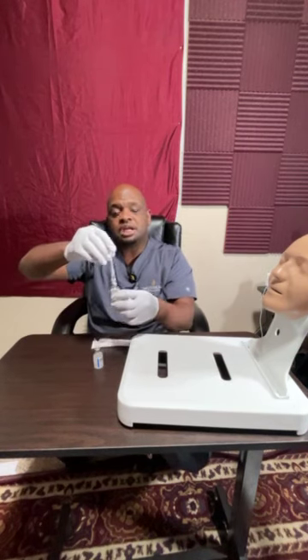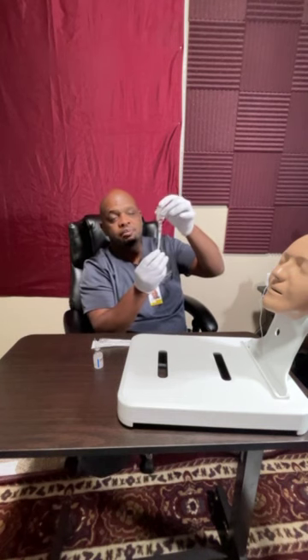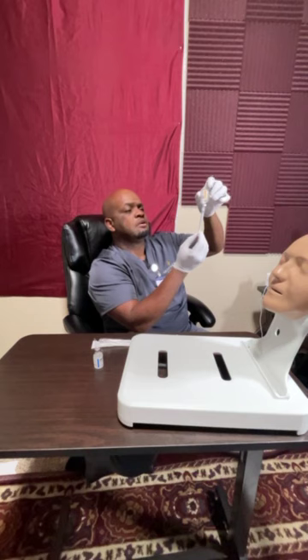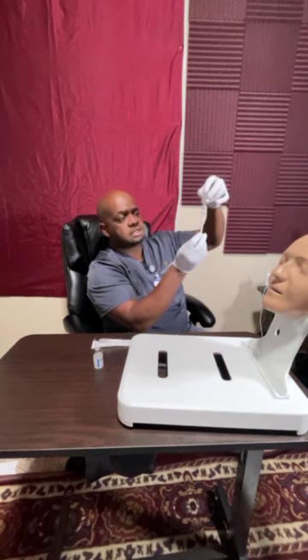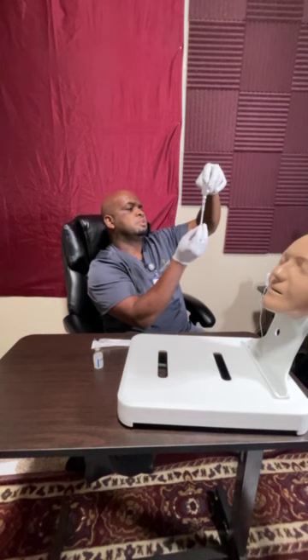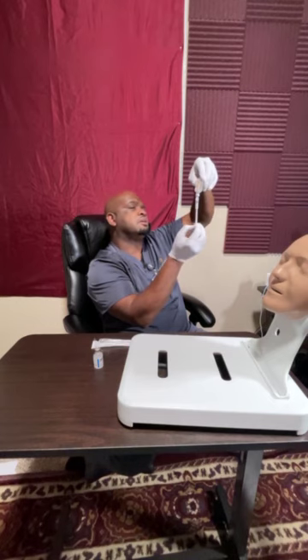Now, this time, I am actually going to be turning the bottle upside down. And from here, I will draw up 4 units of insulin from the regular. All right, so 4 units. Let's see where the 5 is at. And there we are.